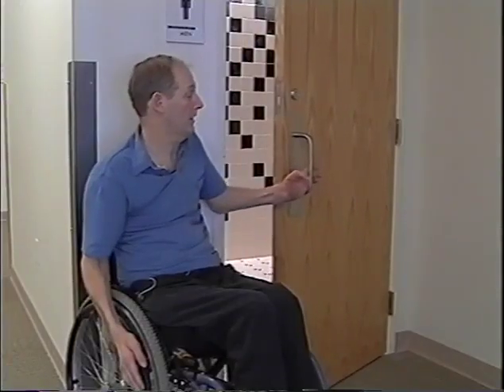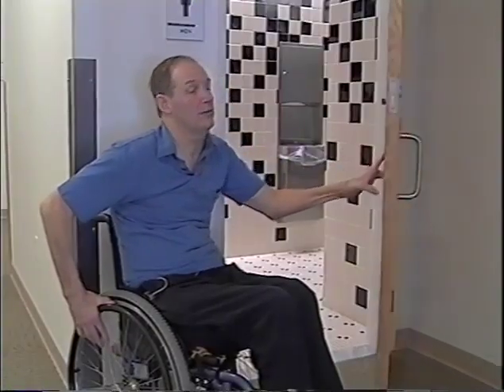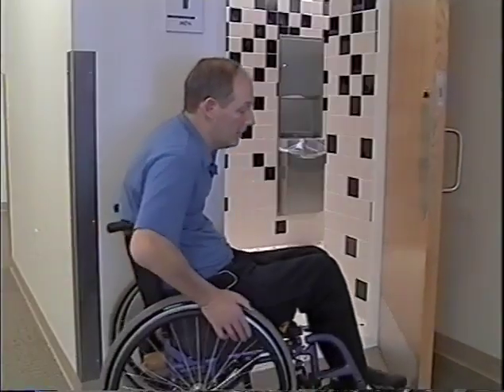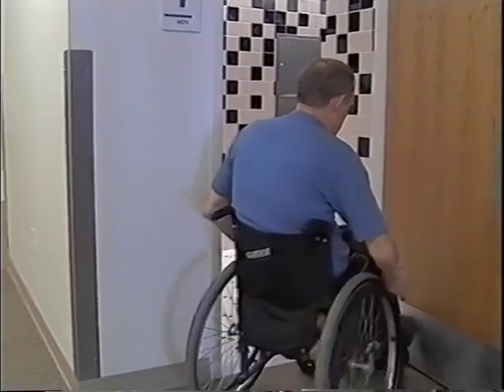This entails getting your hand into the loop here and turning and using the wall as the brake and pulling the door open and getting your hand out of the door and pushing it again. Now you can do several things here. One, if you have enough triceps, you can throw the door away and turn your front end into it and then roll on in.